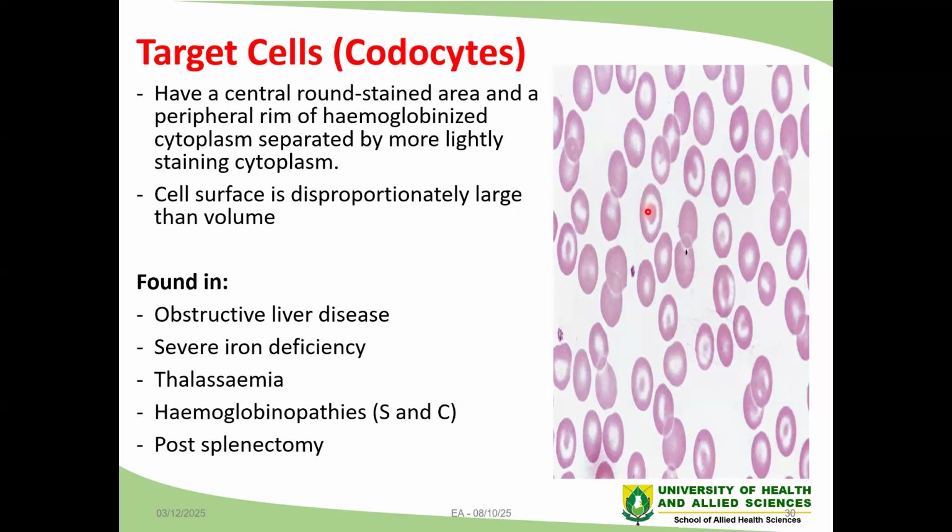So this is also found in a blood film, but like I told you, this cell is actually a deviation in the shape of the red cell. It has got nothing to do with hemoglobinization. If you take an electron micrograph of this cell, that is when you realize that the cell actually looks like a cowrie.